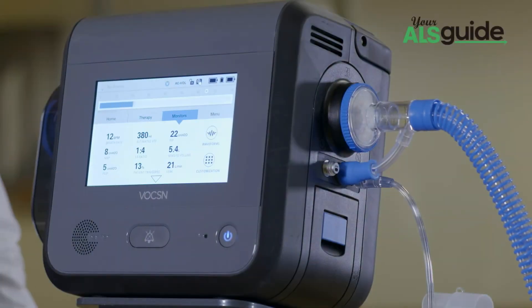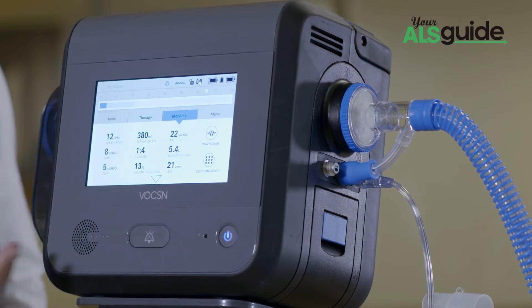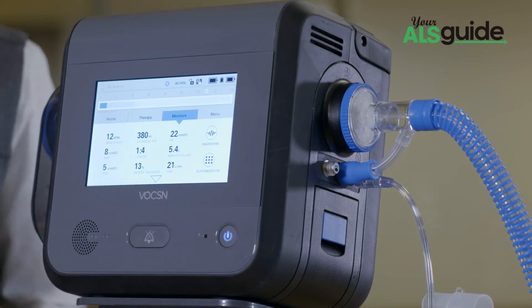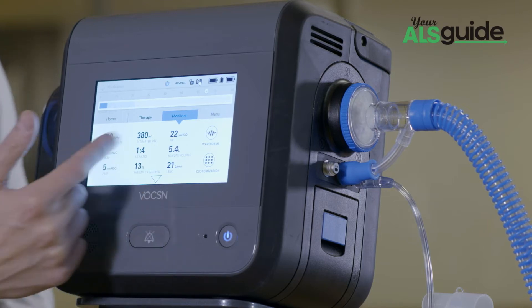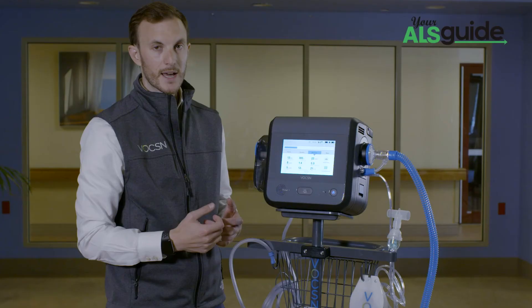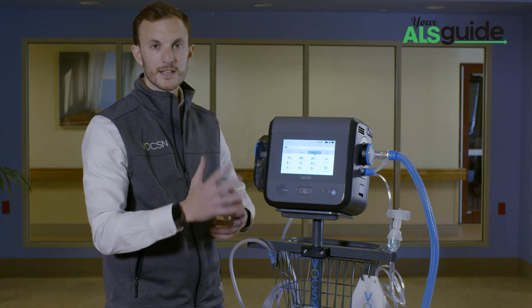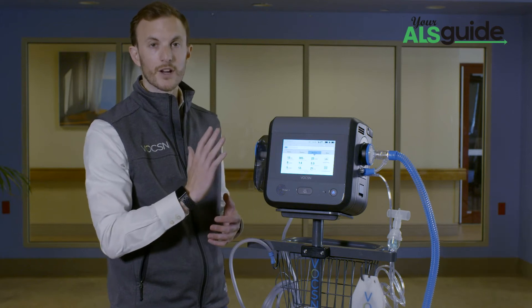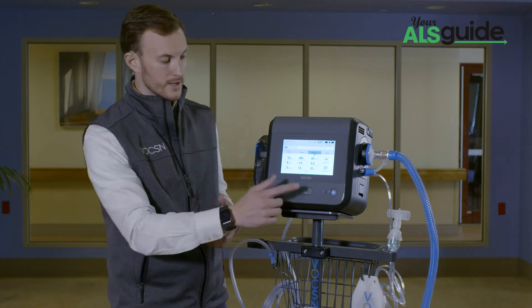I have all of my monitors — all of the monitors that you're used to seeing. I can actually customize these left to right, top to bottom, to make it very easy for me as a caregiver to chart.